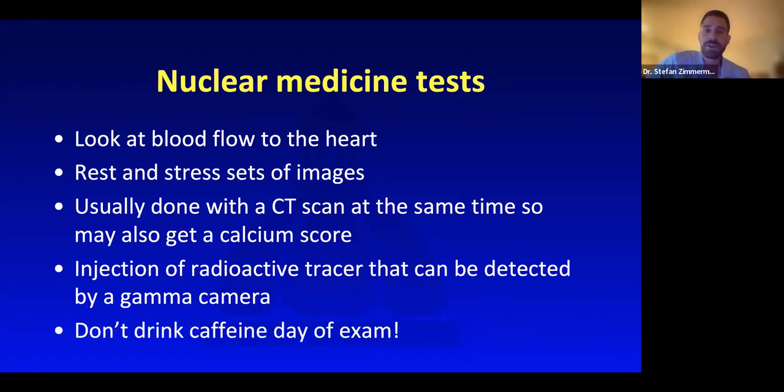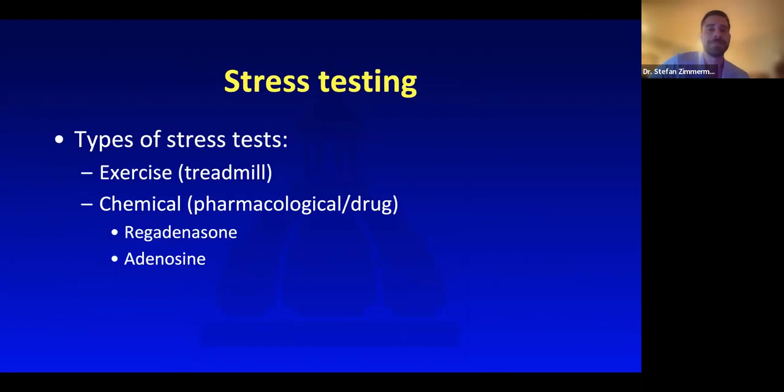One thing to note, if you're scheduled for a nuclear medicine stress test, don't drink caffeine the day of the exam. And that's going to actually be true for several of these studies. So I'm just going to keep hammering that home for the most part. Don't drink caffeine if you have any of these tests.